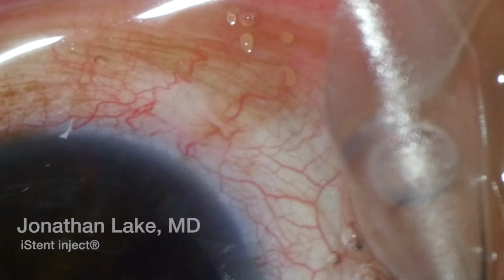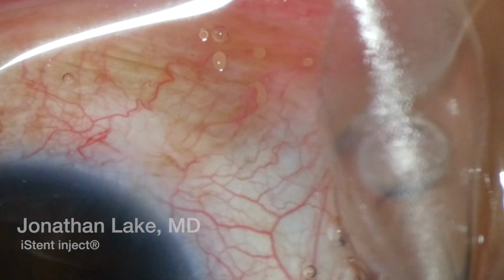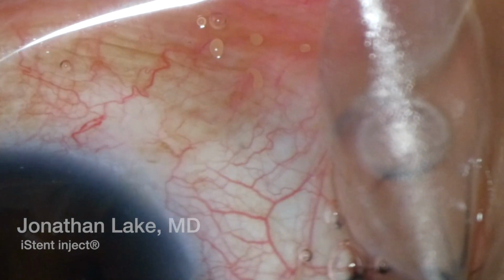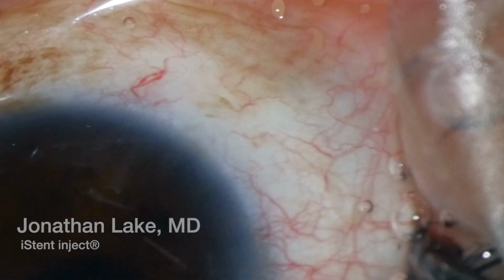the collector vessels, and here we see the BSS going through the episcleral vessels, and here in slow motion. So this was a great case.